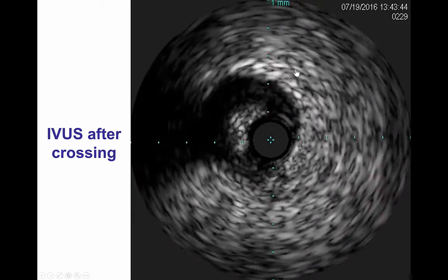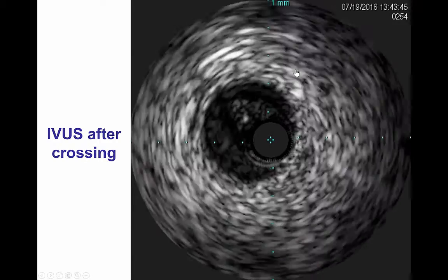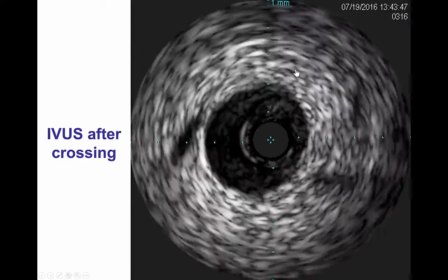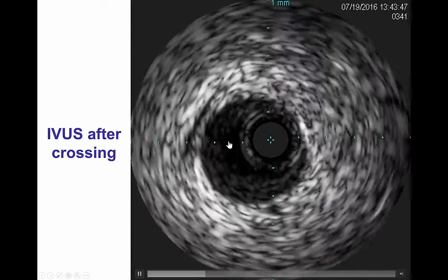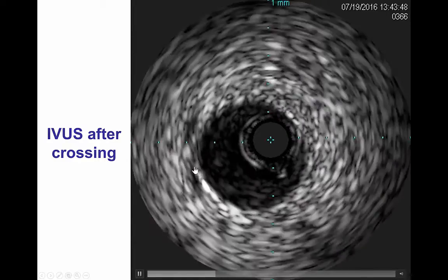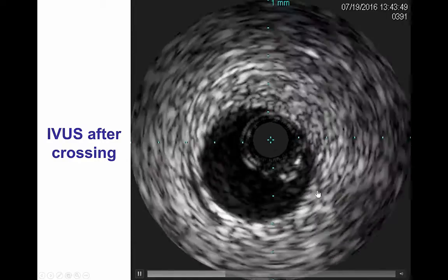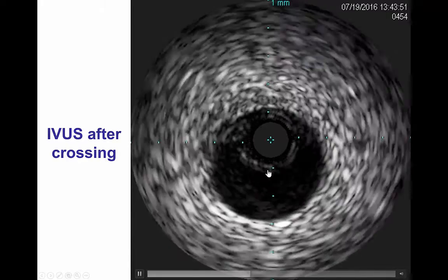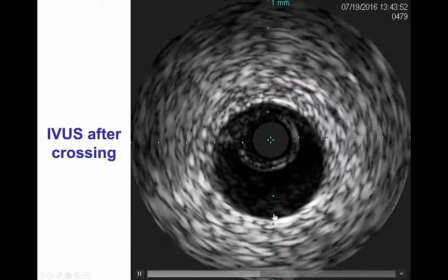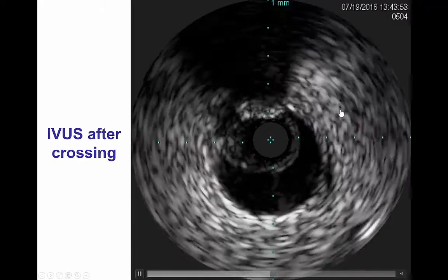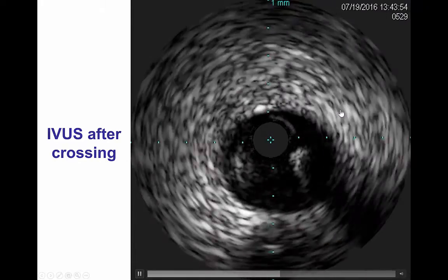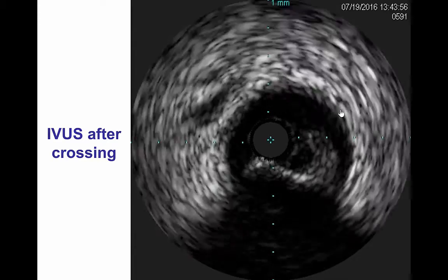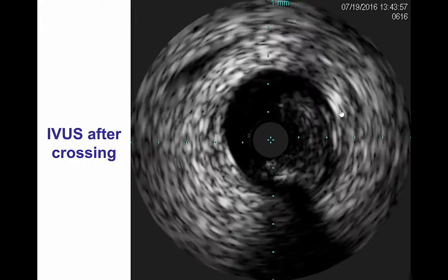We performed intravascular ultrasound to determine the location of re-entry and also the vessel size for choosing the appropriate stent size. The vessel measured approximately 3.5 mm in the mid portion and up to 4 mm proximally. The vessel continued all the way to the ostium. We also had extensive dissections created by both the retrograde wire as well as the antegrade contrast injection.